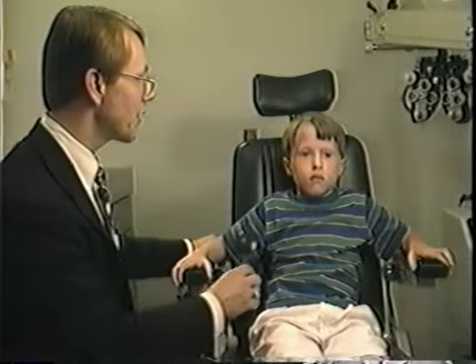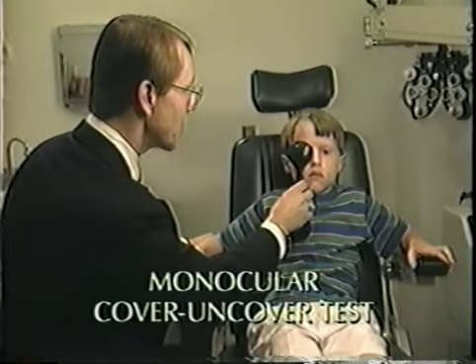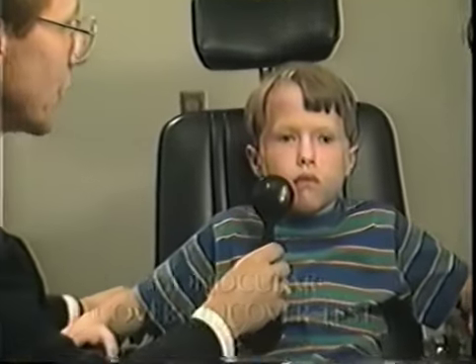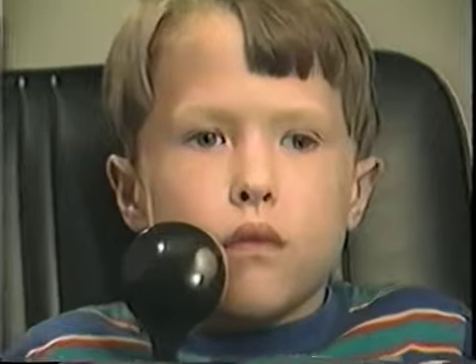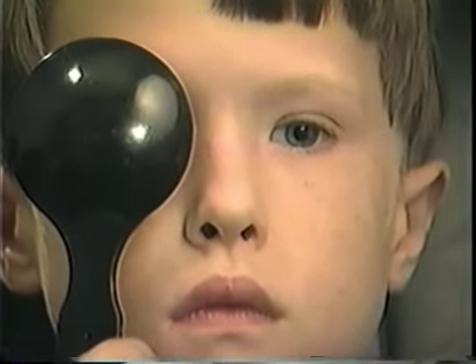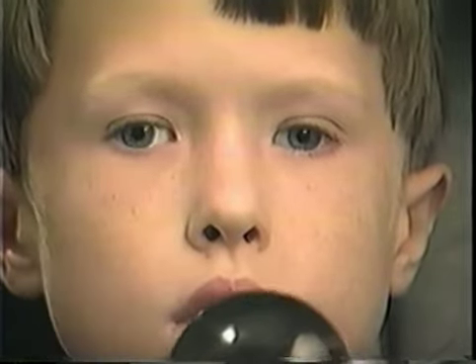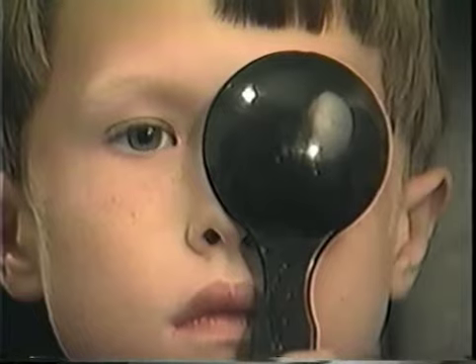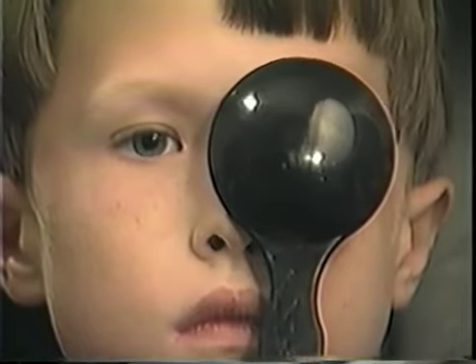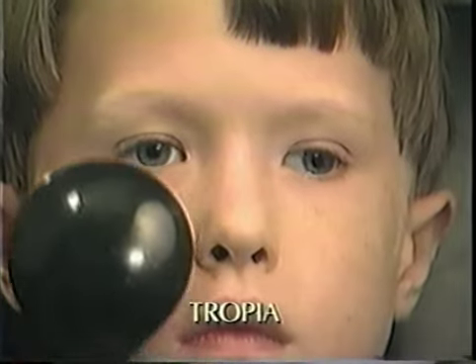The first type of cover test is the monocular cover-uncover test. It is the main test to differentiate a phoria, a controlled or latent strabismus, from a tropia, a manifest strabismus present under binocular conditions. Cover one eye and look carefully for any movement in the non-covered eye. If the uncovered eye must move rapidly to fixate on the target, a tropia is present.